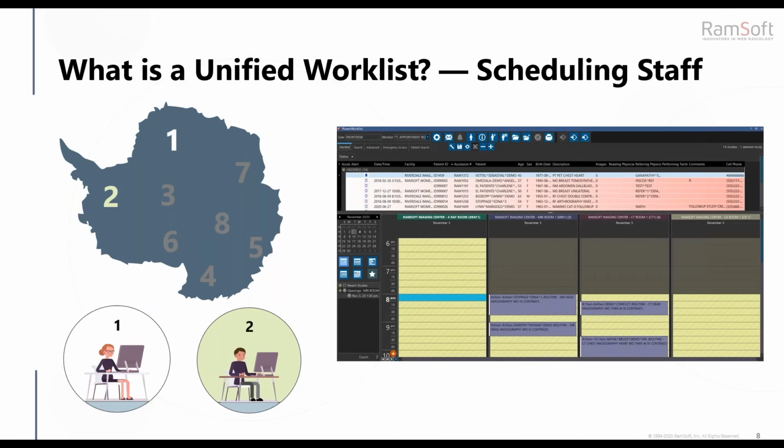So for scheduling staff, what's a unified worklist? How does it work for them? Scheduling staff can work from one list regardless of location, right? I mentioned this practice with 8 locations. You can have one centralized person or persons doing scheduling, and from any of those imaging locations, or even working from home, essentially anywhere with an internet connectivity. Although I really wouldn't recommend doing it at Starbucks, for instance, that could compromise protected health information. You really want to do it anywhere with an internet connection that's secure.